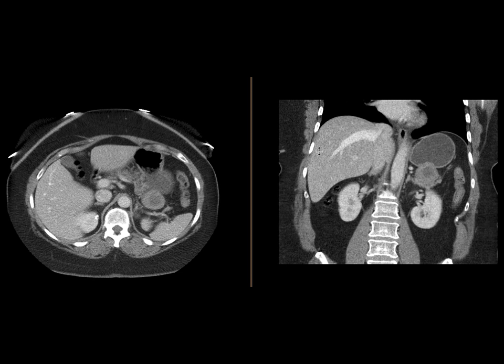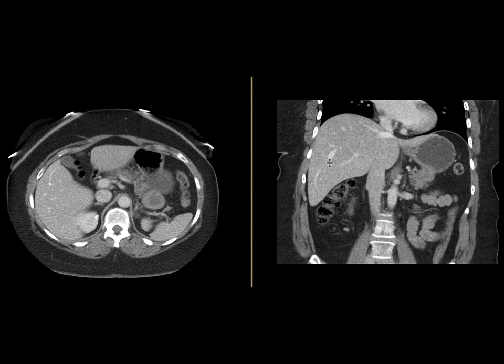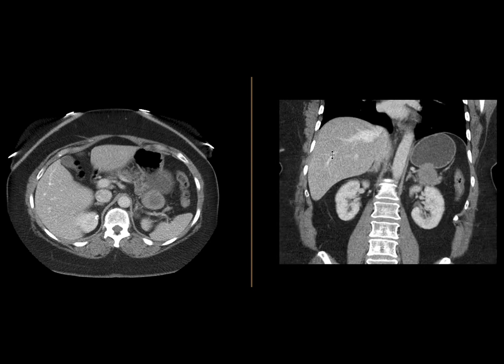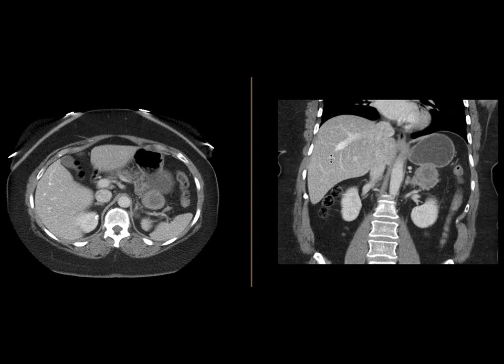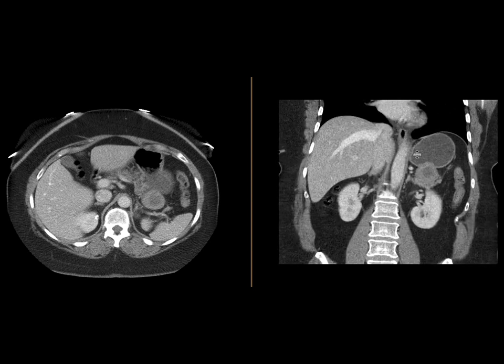The differential possibilities for a mass arising from the stomach — you can think of adenocarcinoma, but this would be a very unusual appearance. Those typically manifest as areas of gastric wall thickening.